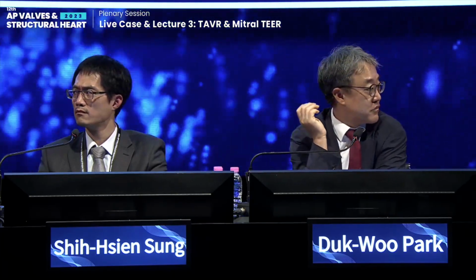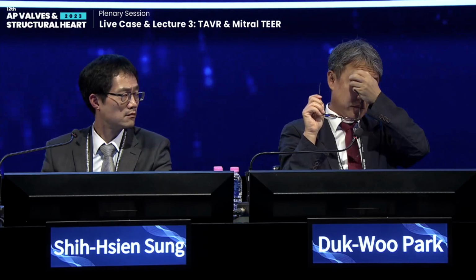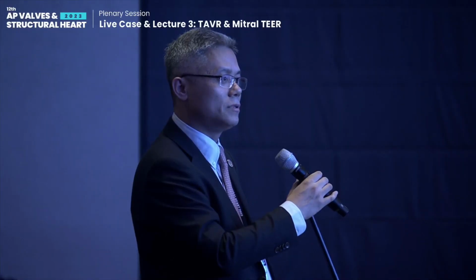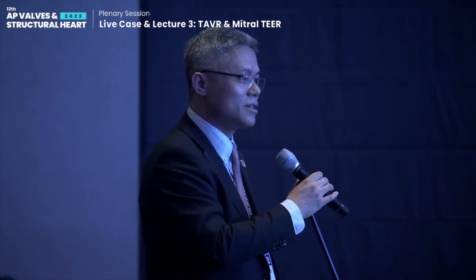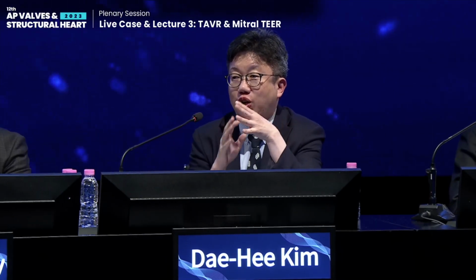Dr. Zhang, I have one more question. In your presentation, the patients with a larger annulus, over 80, had poor survival, right? Pardon? The patients with a larger annulus area had poor survival. Yeah, that's right. Why do you think so? Which parameters were different between the two groups?